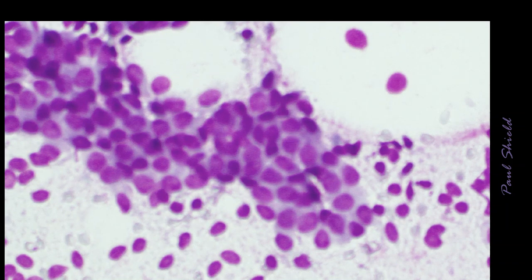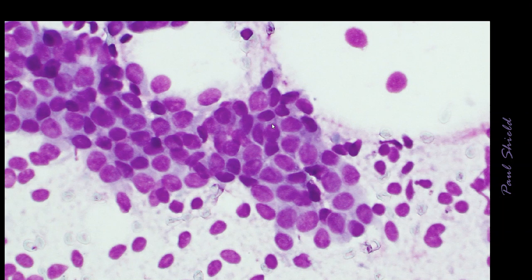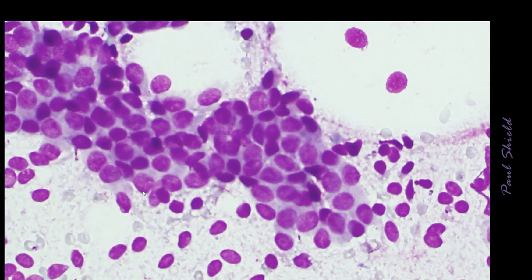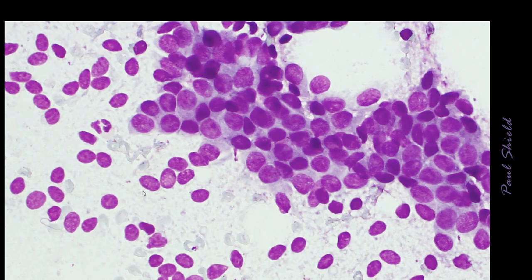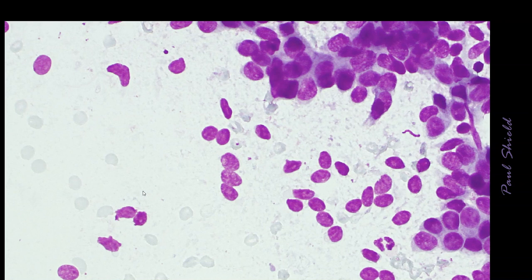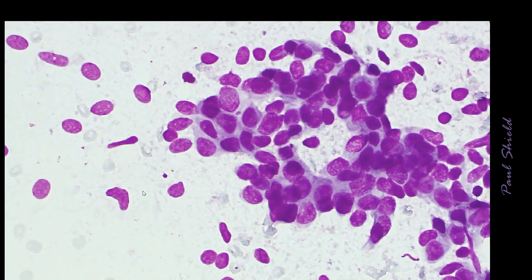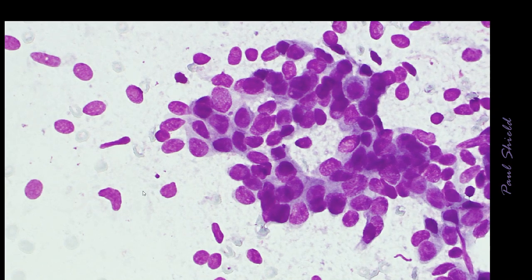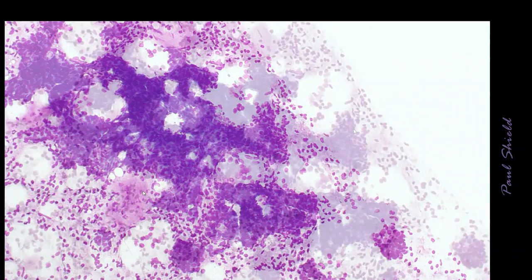Just on higher power, you can see that bimodal pattern in the Giemsa stained epithelial cells. And notice that the nuclei are fairly uniform. In fibroadenoma, particularly in younger patients, you can get quite a bit of variation in nuclear size sometimes, what we would call nuclear atypia, but it's the pattern that's all important. So if you notice that there's a bimodal pattern like this and bare bipolar nuclei in the background, then you can be assured that it's benign.